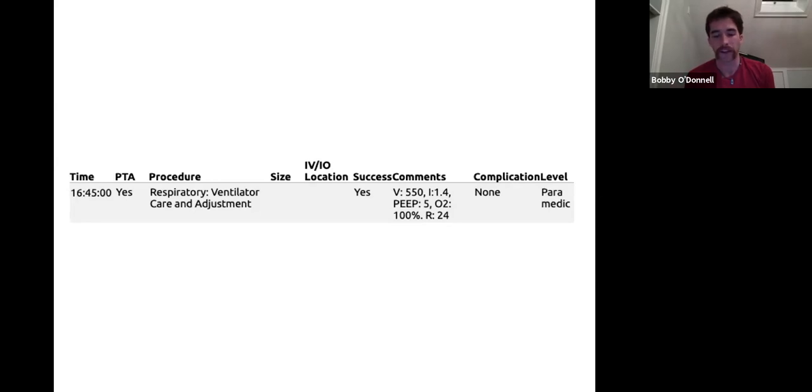I guess the only thing that I'd like documented, if you can remember it in your narrative, is if our vent was used. That's one of the things we're looking more into. The reason being, we take patients from smaller critical access hospitals that, especially at night, only have one RT on, and we have ventilators on our trucks with the purpose that we should be using them. I understand in the emergent setting, when you want to get people out fast, then that's different.